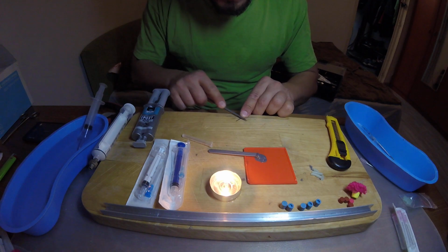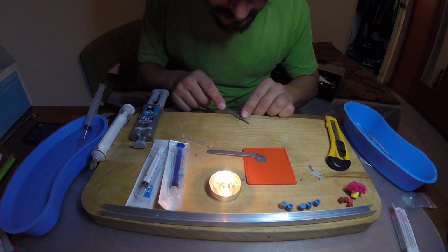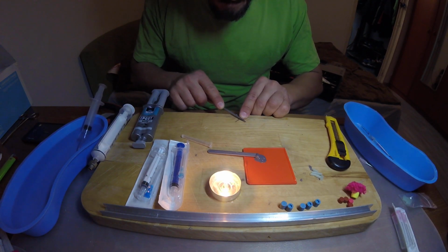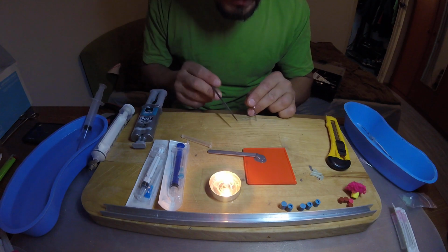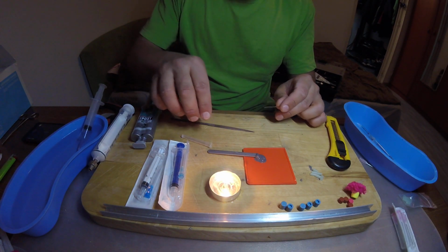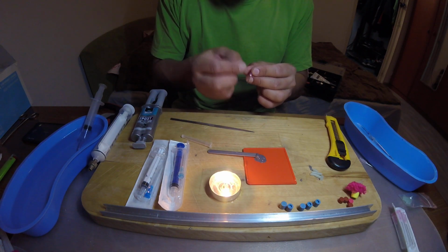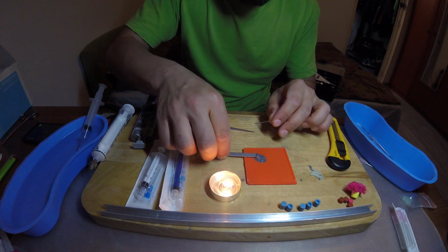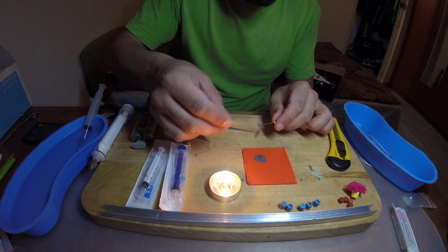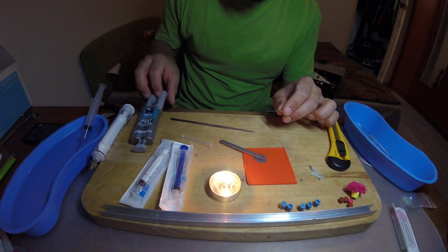If you go just like this, more. See, you have a hole here that you can use. This is where the substance will get out, but you also have to close the tip of the needle, and we are using the epoxy metal here.